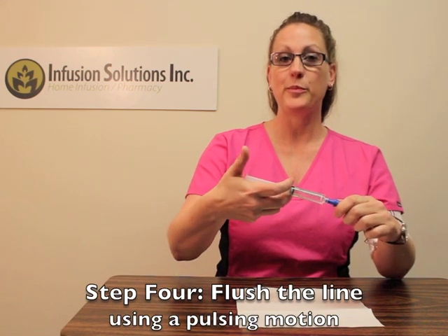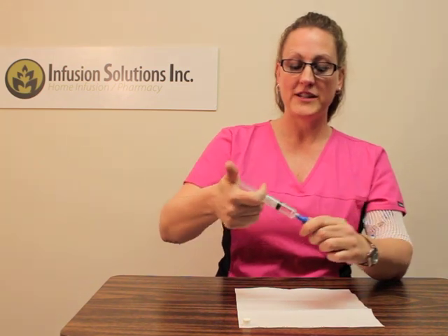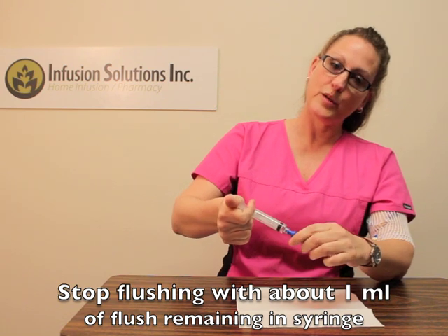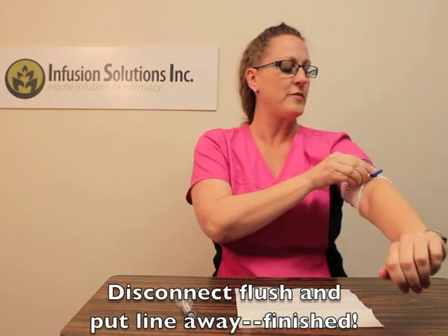Flush it in a pulsing motion, and stop about one mil from the end to leave that little bubble inside the syringe and not get it in your line. Then just unscrew it and you're done. Put your line away.